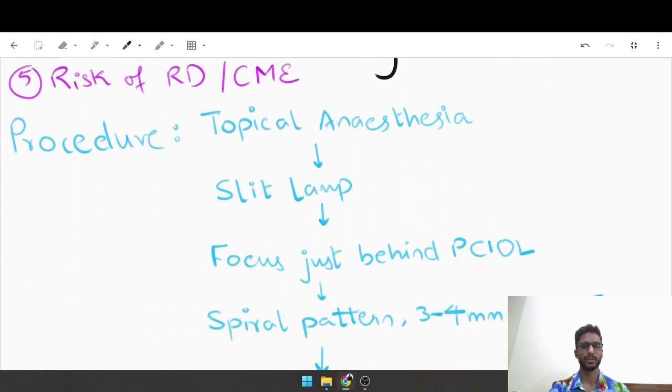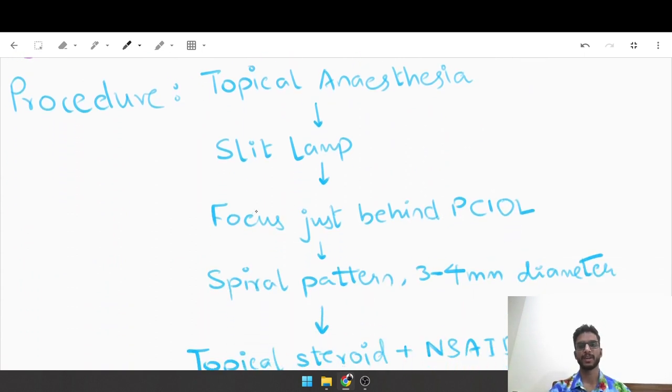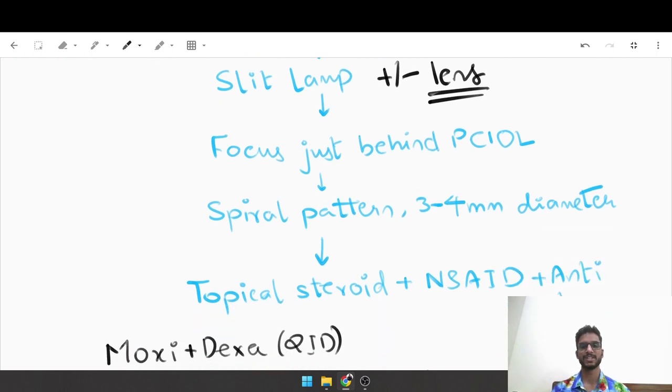How do you do it? You firstly anesthetize the patient using topical anesthesia - you use proparacaine eye drops. Always perform capsulotomy on a slit lamp. A slit lamp is an instrument that helps stabilize the patient and stabilize the surgeon. You can or cannot use a plus focusing lens - it really depends on the surgeon's preference. When you begin, it is best not to use a lens because there are that many fewer moving parts. You focus just behind the PCIOL.